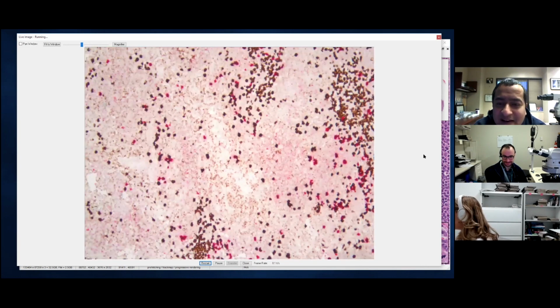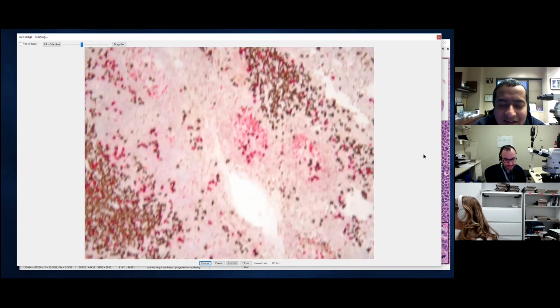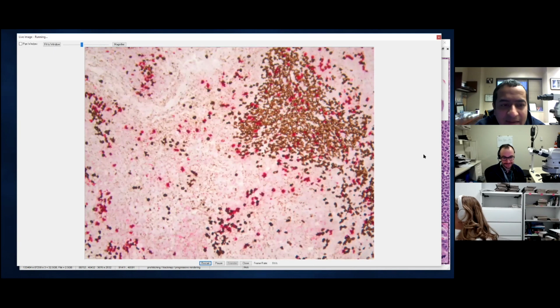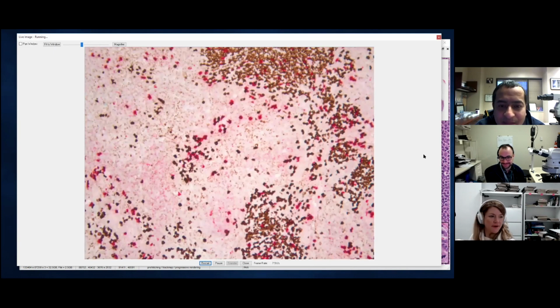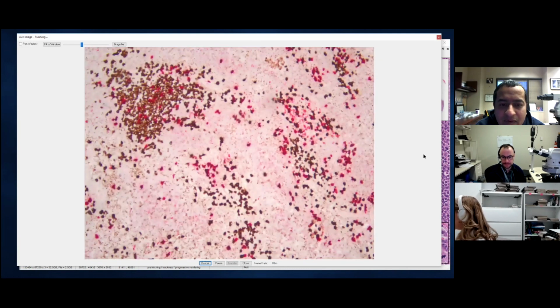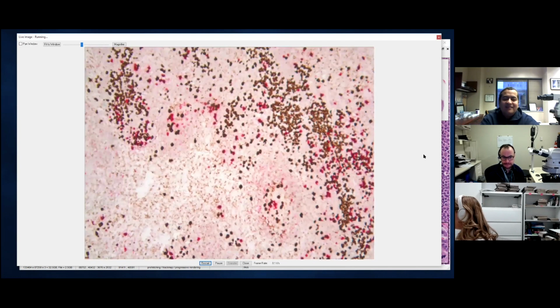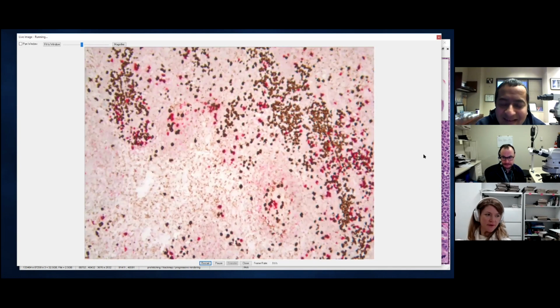Can you tell what's plasma cell and lymphocyte on this, Eve? Because I can't, morphologically. Oh yeah, you can. Well, the ones that are the darker staining ones, those are the plasma cells, the larger cells. So the ones that are very fine, where we're not seeing stuff very well. This stain we actually made, I don't know if you can order it because I thought it's still confusing. It's still kind of getting rolling.